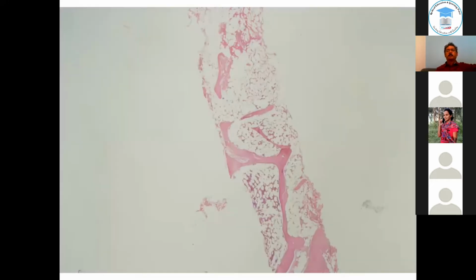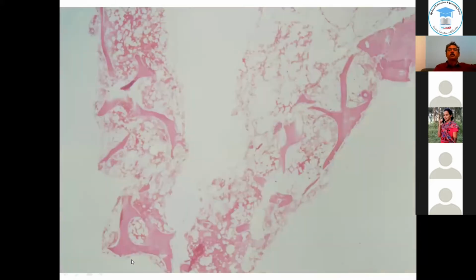We do the trephine. Now remember, this lady was 67 years old, so you'd expect something like 25 to 40% cellularity in a normal trephine. And this is clearly not that. All of this is fat. And here is a little bit of blue, which is marrow. Again, 2 more cores in this patient showing just fat, nothing else.